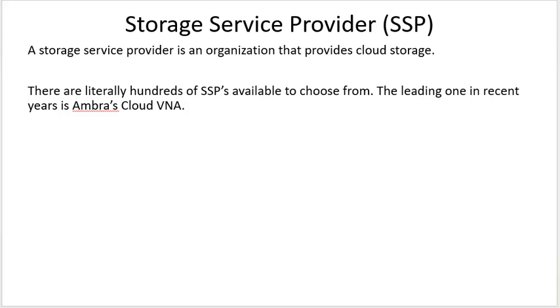Storage Service Providers is an organization that provides cloud storage. There are literally hundreds of SSPs available to choose from. The leading one in recent years, the last 2 or 3 years, they've been rated best in class, is Ambra's Cloud VNA. A lot of hospitals use that for their storage.